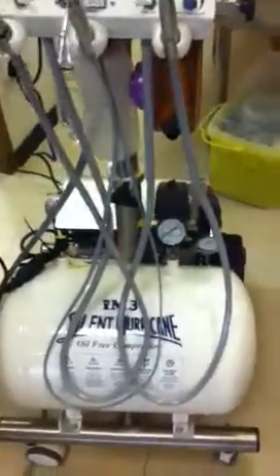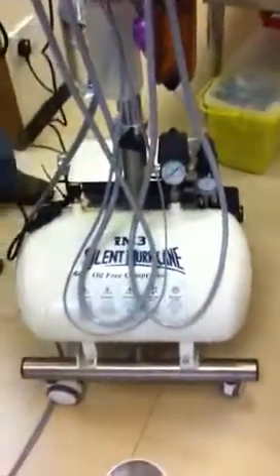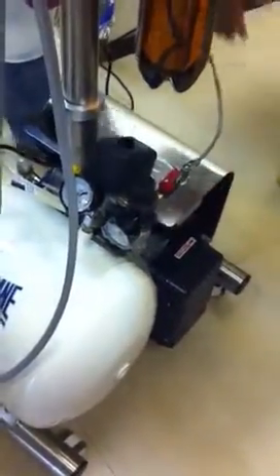Look at it closely. There's a 1 and 0. There's a 0 here, 1 here, so this is the on position. This is the off position. And back here there's a trip protection device, such that if there's a trip, there is a button, as mentioned here, push to reset.